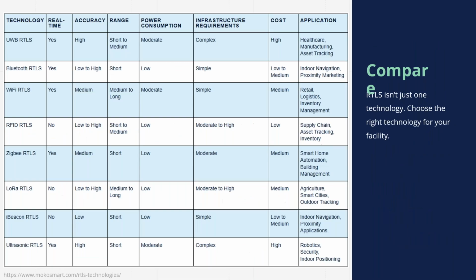Yes, sir. I had someone tell me that they were inspecting something once a year, but the battery lasts about 9 months. So how does that work out? You almost need to, when you're inspecting it, turn on sleep mode for 6 months, and that's what they need to get to. But yeah, I saw another hand go up over here.